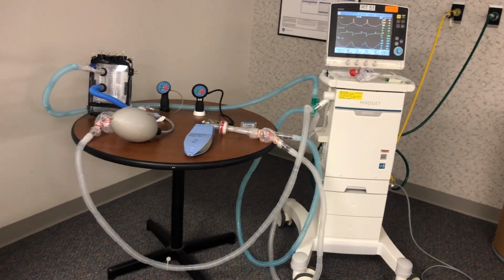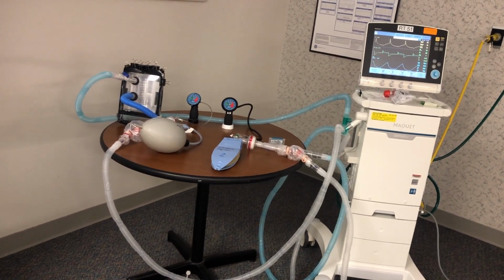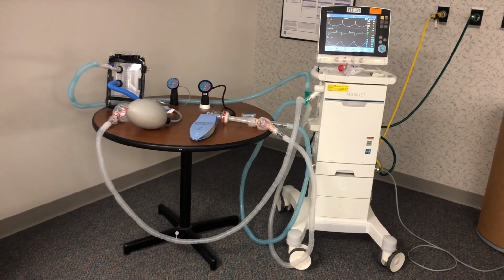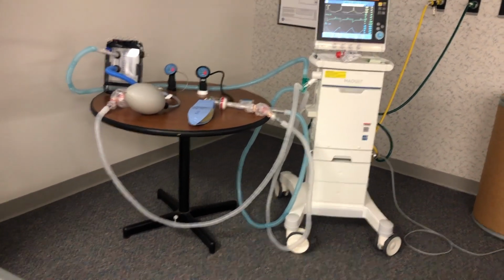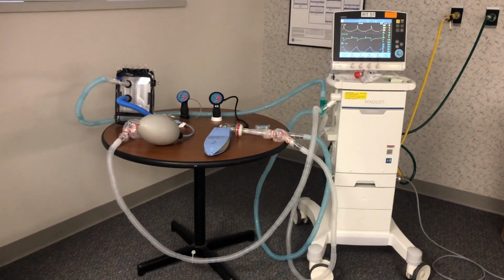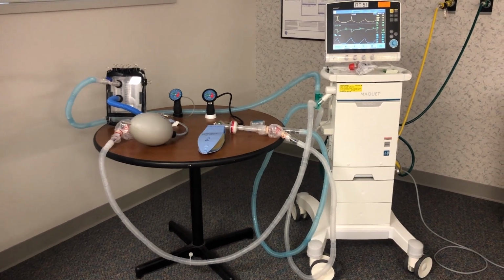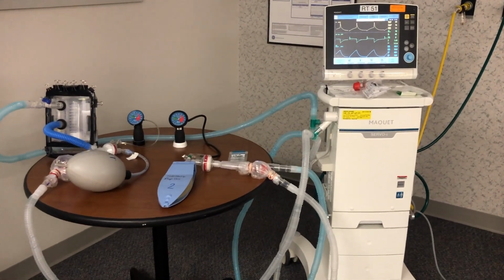This is very important because if you have an older patient and there are younger patients too, I don't want to be in that situation where I cannot offer anything, at least to the older patients, and hopefully this would buy us some time or help us to ventilate patients till we get more ventilators. Please feel free to ask me any questions. I will also put in the comments about different caveats and certain problems that I encountered.